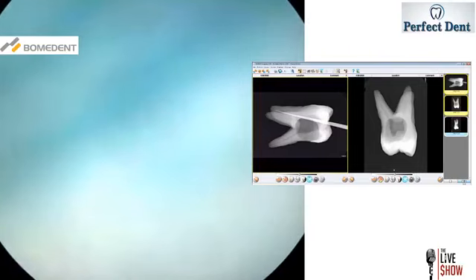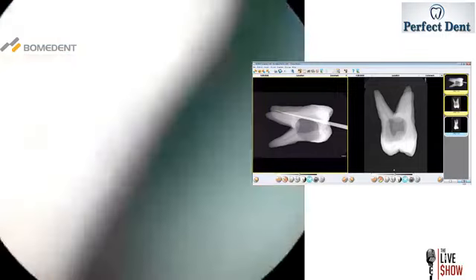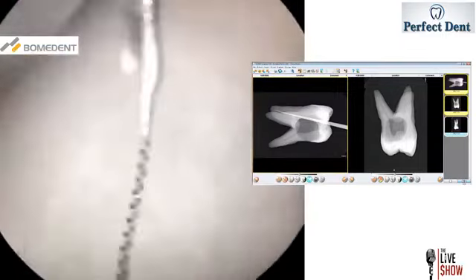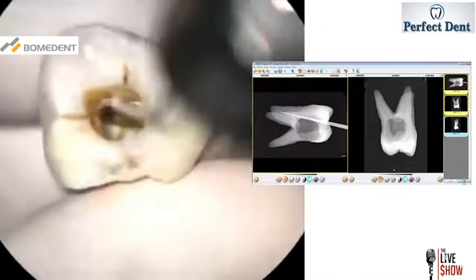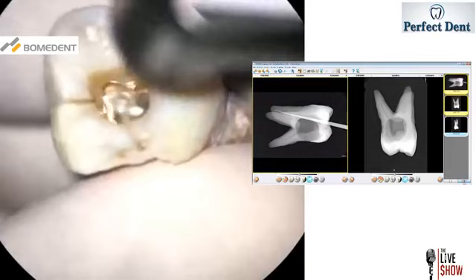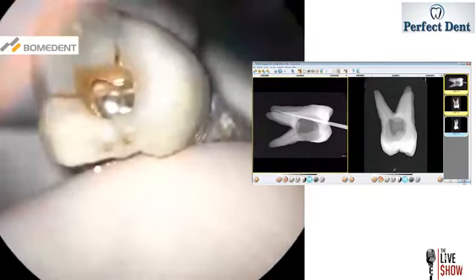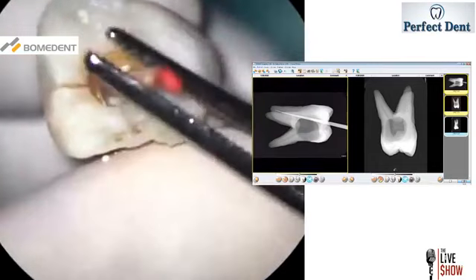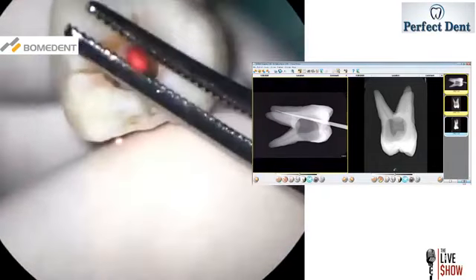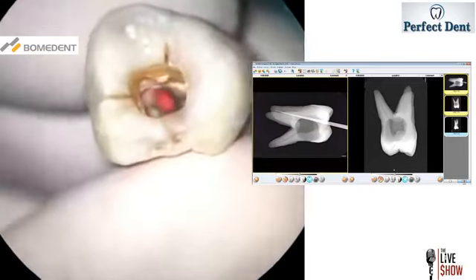Okay, so my assistants have mixed my sealer. So I'm just going to insert some sealer here into the canal. Activate, please. And then we rotate it into the canal very nicely. Thank you. Canal cone. And then I will insert my cone to the working length as previously discussed. Now, this is the first step of the warm vertical compaction.